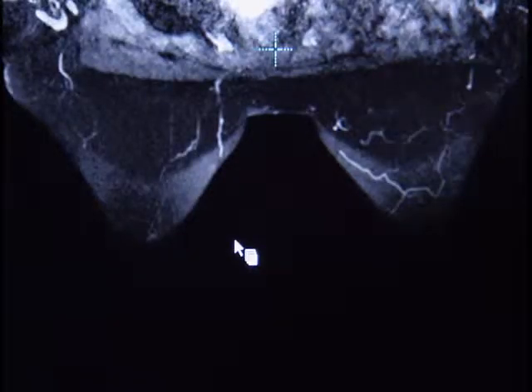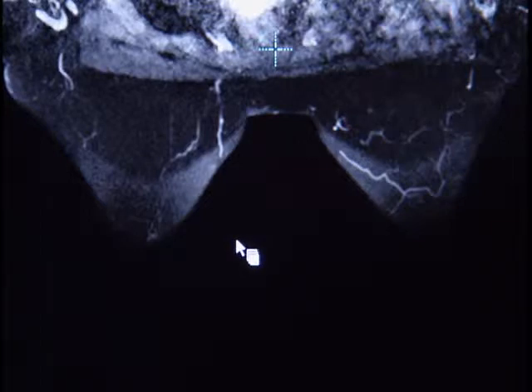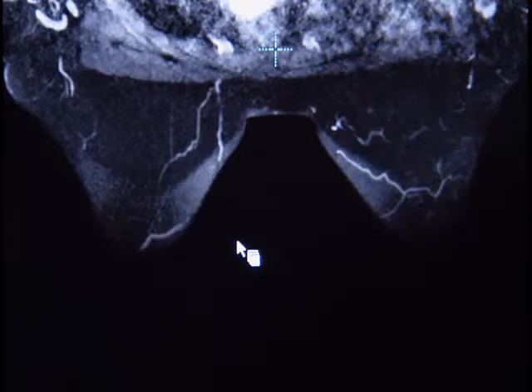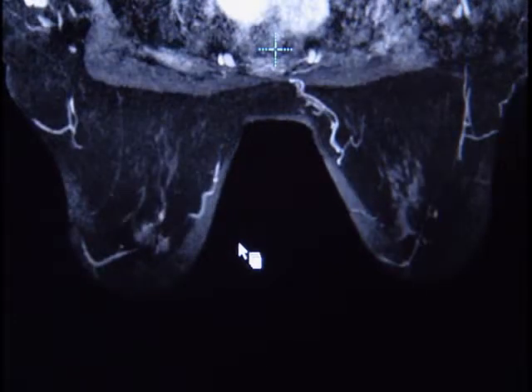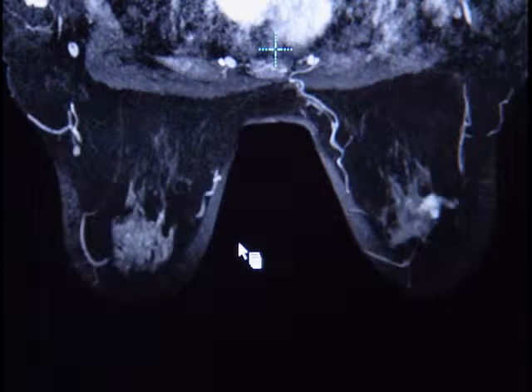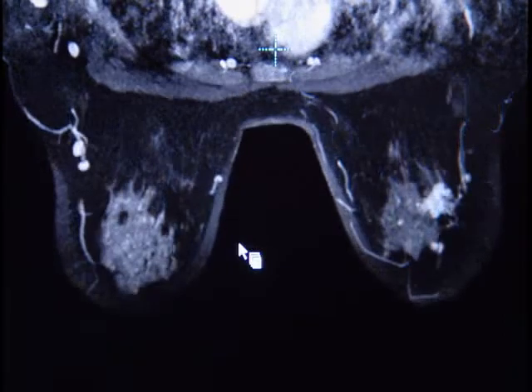Selecting from a pull-down menu, we bring up our 1-minute fat-saturated thin MIP images. These are reconstructed at 15mm slice thicknesses. This again allows us to get an overview of the breast, however with significantly improved anatomical detail over the 1-minute subtraction MIPs.